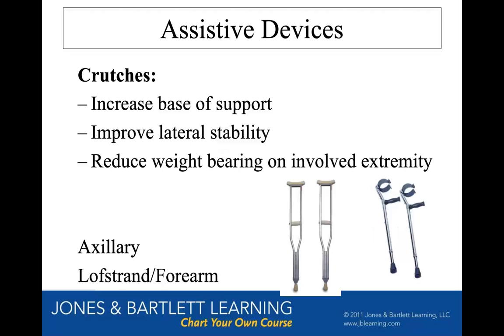Crutches: probably every one of us or most of us have been on axillary crutches before. Axillary crutches are the crutches we're used to seeing, that go up under your armpits, and then you've got the hand grips, and they change height at the legs and at the hand grips. We have crutches of all sizes and shapes, tons of pairs in our lab. They're called axillary crutches, the full name, because they go up under your armpit, and your armpit is called the axilla, or the axillary region.